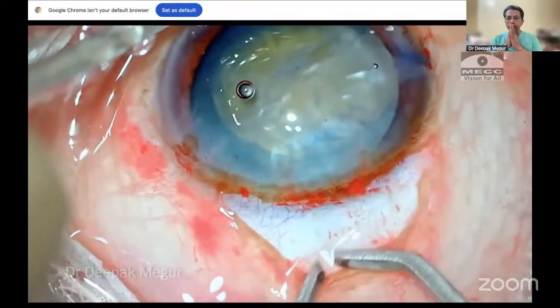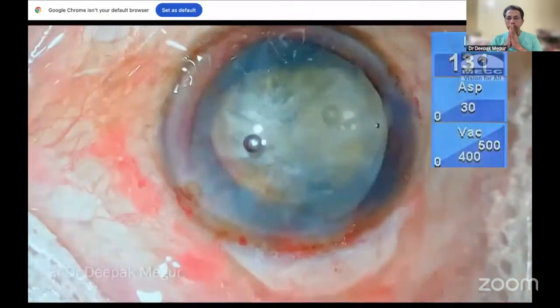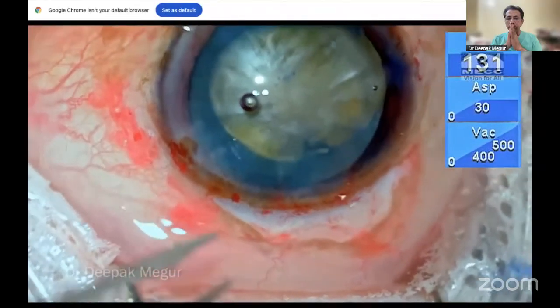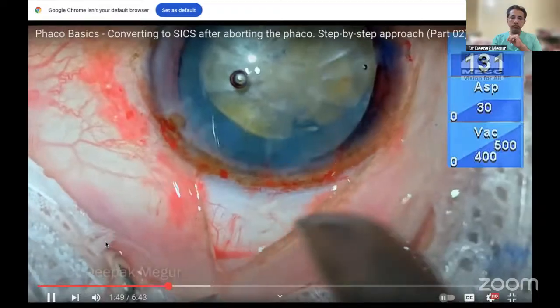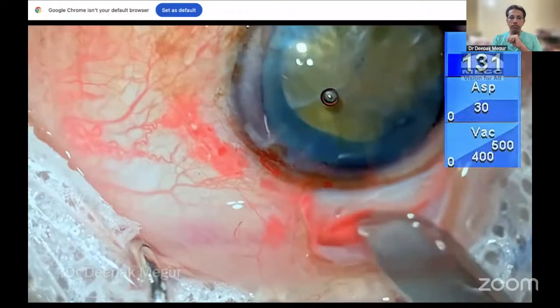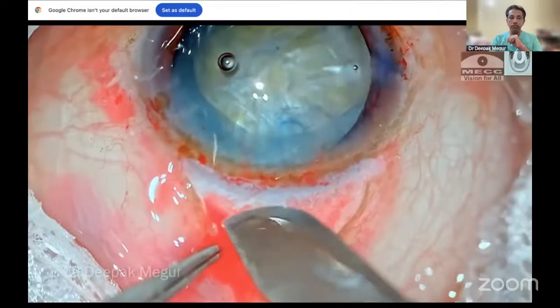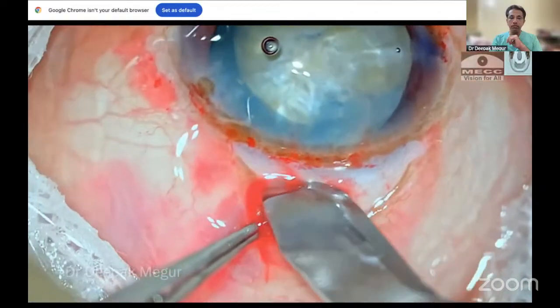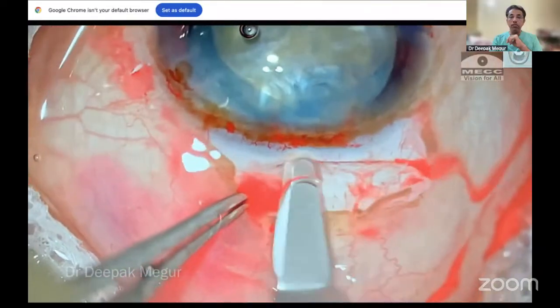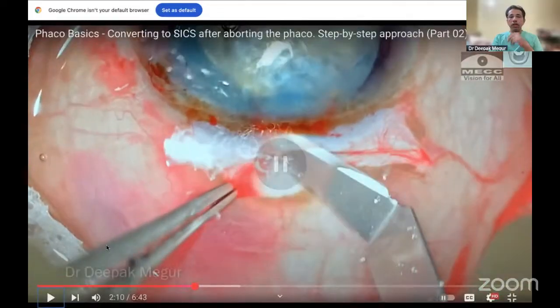The superficial bleeding episcleral vessels are cauterized. My plan now is to make a fresh sclerocorneal tunnel, which would be at a slightly different plane than the original 2.8 millimeter incision which was done in this patient. To fixate the globe, I usually perform a small scleral groove. Mind you, I'm not using any superior rectus suture in this eye. If some surgeons are uncomfortable, they can always put in a superior rectus suture, but that has to be done before doing the peritomy. I'm beginning to make the tunnel just paracentral to the original 2.8 millimeter incision.